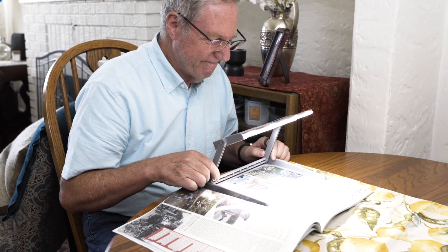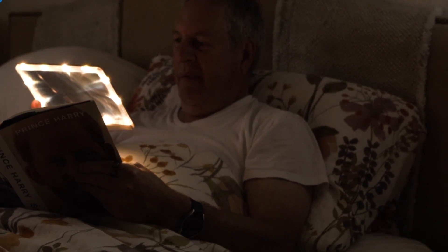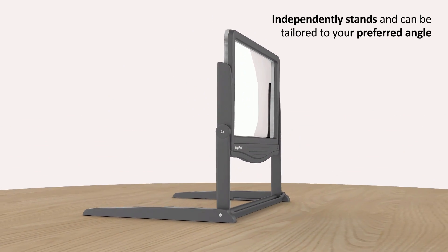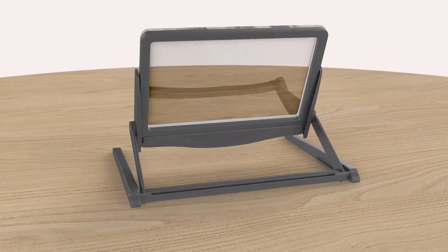The design of our magnifier is so easy to adjust, detach and reattach. The magnifier stand can be tailored to your preferred angle. So if you're laying in bed, at the kitchen table, or in the car, you will get the maximum of comfort. It is fully adjustable with a 360-degree rotation.